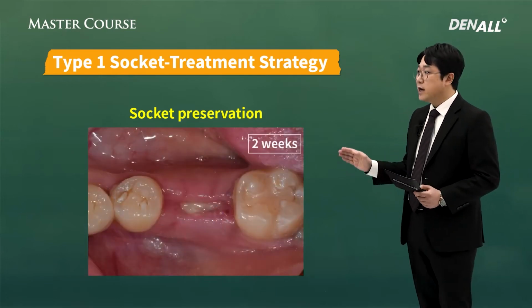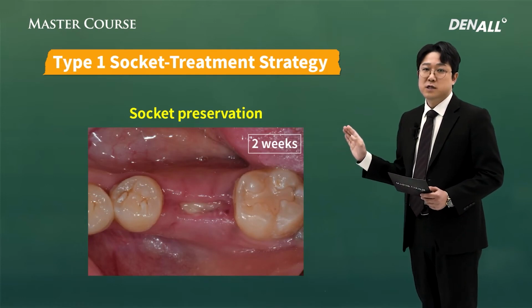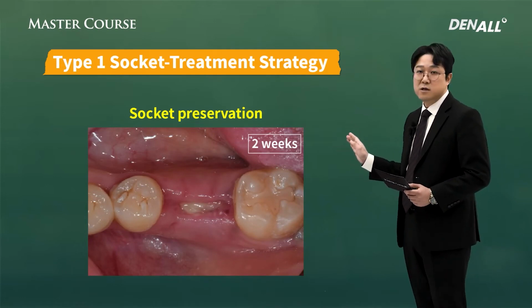This is 2 weeks later and the suture was removed. The healing is nicely done.